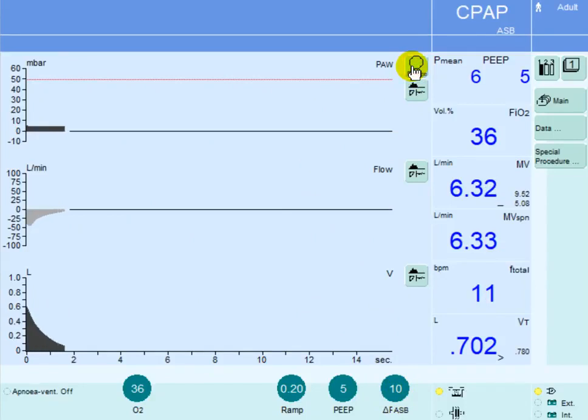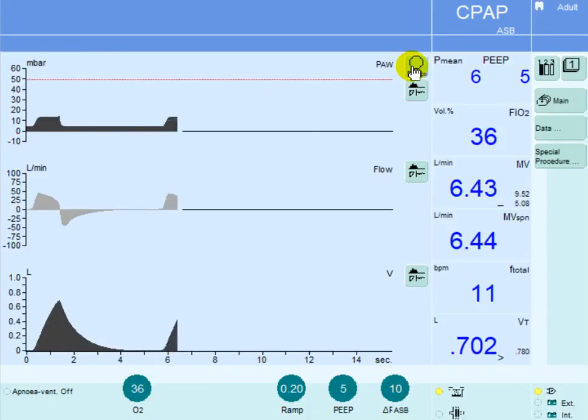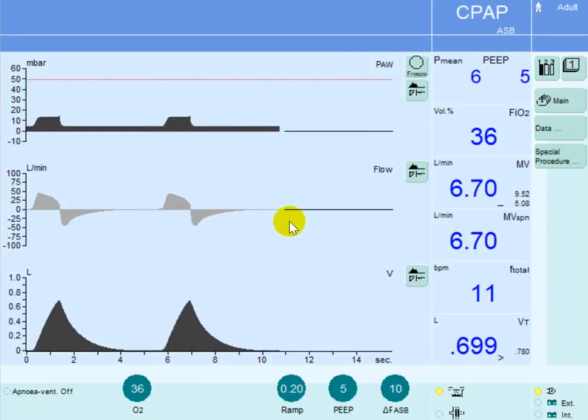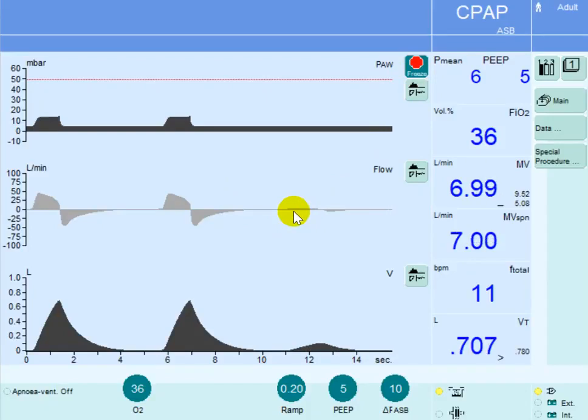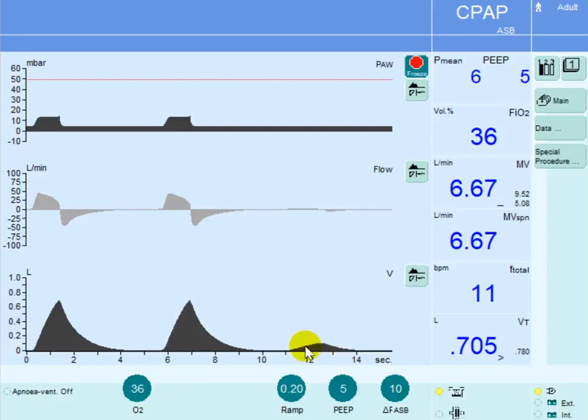Now every time the machine is triggered, the patient should at least generate 5.7 liters per minute. Take a look at this breath here. What you see is the patient had some initial inspiratory efforts and he generated inspiratory flow and inspiratory volume.